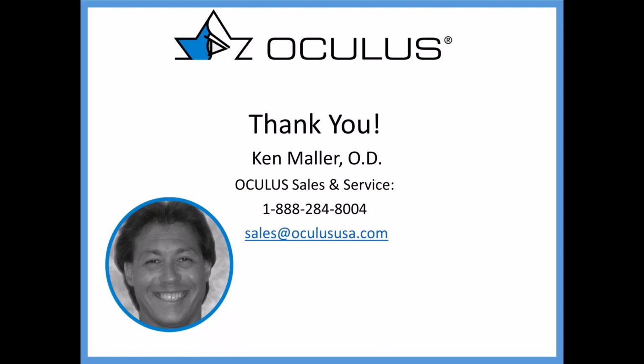Top of the list is it's a horrible experience for the patient. They've already been through enough, and putting lenses on that don't feel right or perform properly, or how many times have you put a lens on that's just hanging on barely, and you're trying to get some over-refractive data and the lens pops off in the middle of all that. That's useless time to me, and it's inconvenient and very tough on the patient as well.